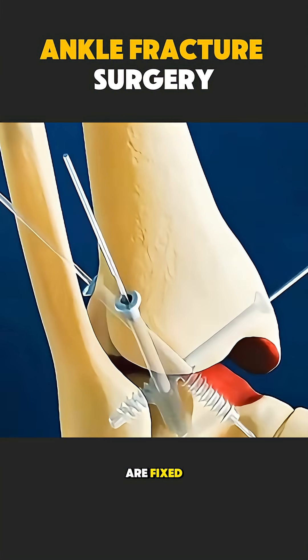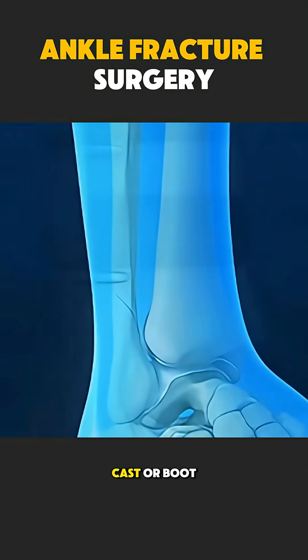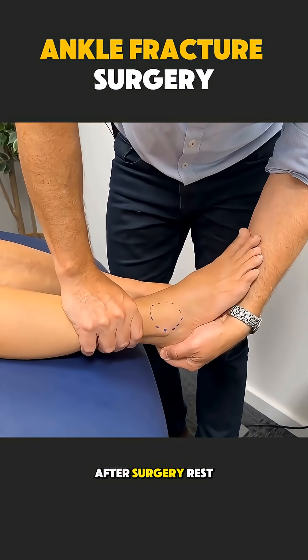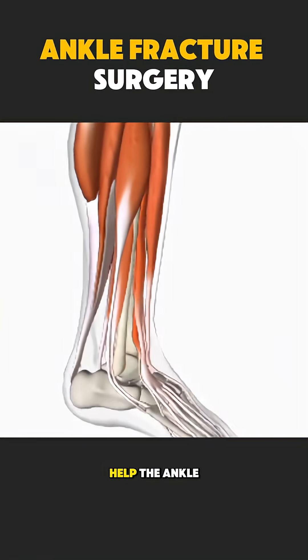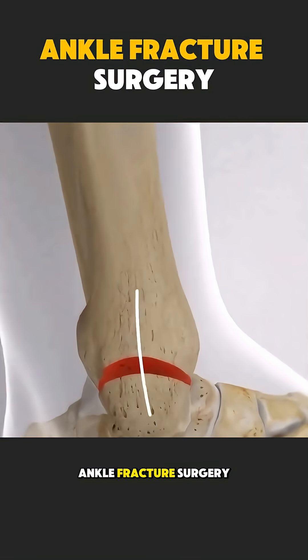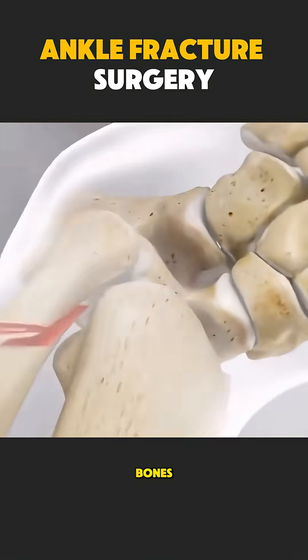Once the bones are fixed, the ankle is protected with a cast or boot. After surgery, rest, physiotherapy, and gradual movement help the ankle heal and regain strength.